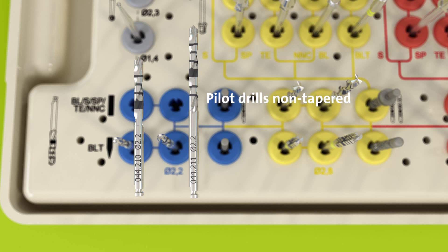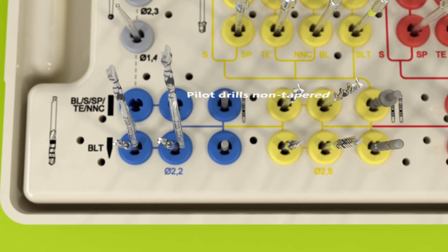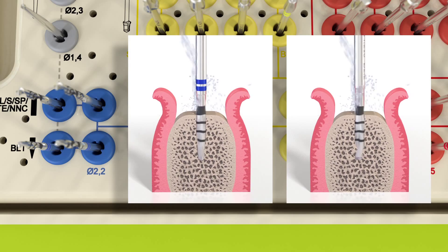The 2.2 mm pilot drills, both tapered and non-tapered, are stored in the blue inserts. For each drill, there is a short and a long version, depending on the available space in the patient's mouth. They are used for the first implant bed preparation.